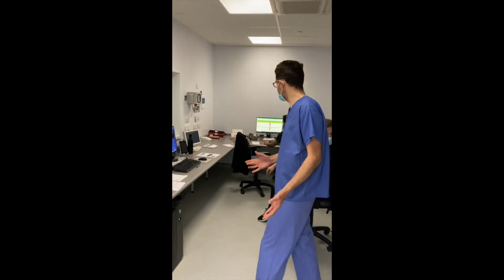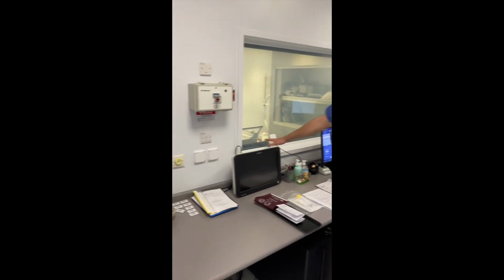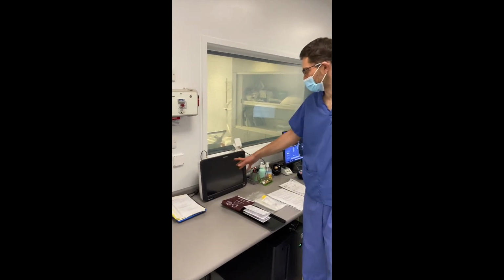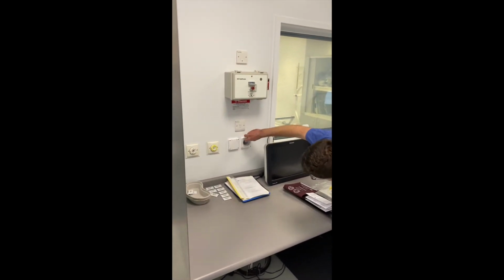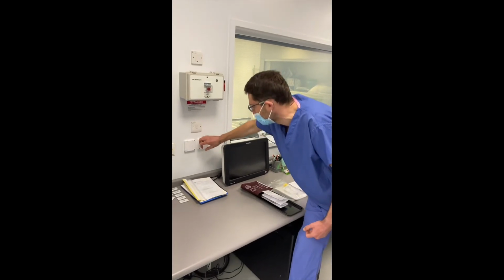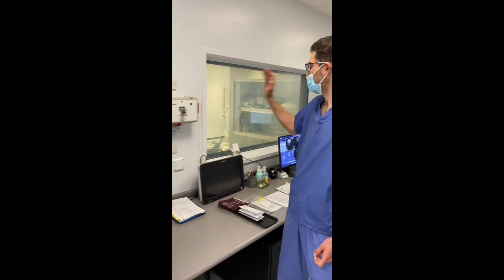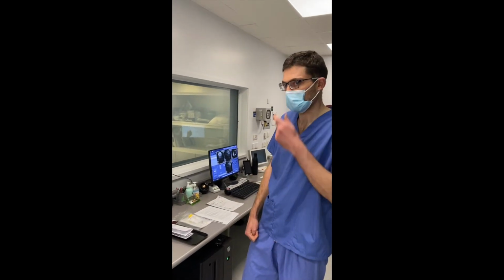MRI control room, some lovely MRI staff working in it. This is the monitor that will connect to the MR compatible monitoring automatically. Obviously you need to turn it on. And then these are what we refer to as waveguides, holes in the wall to feed the infusion lines through. So the clean doctor will sit here with the monitor and the pumps fed through these holes in the wall to the patient, and control the sedation and potentially vasopressors the patient requires during the scan.